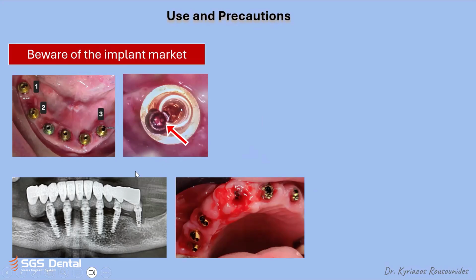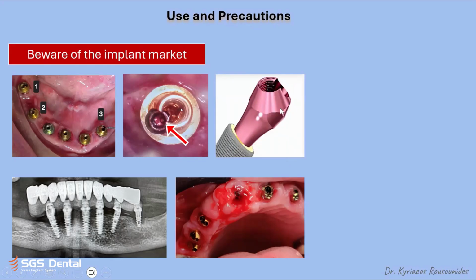They don't have the stability that we need, especially in immediate loading restorations, and this is the result after. If you search the internet with this picture, you'll surely find brands that advertise this nowadays, but this caused a lot of problems in our daily life.